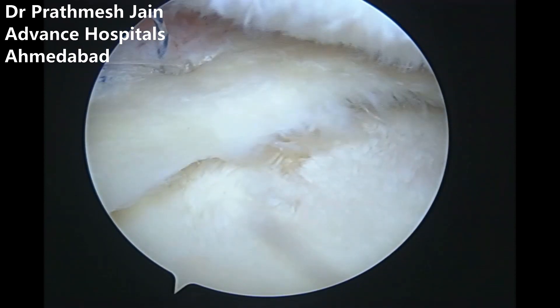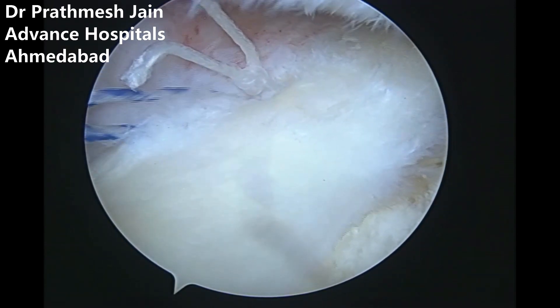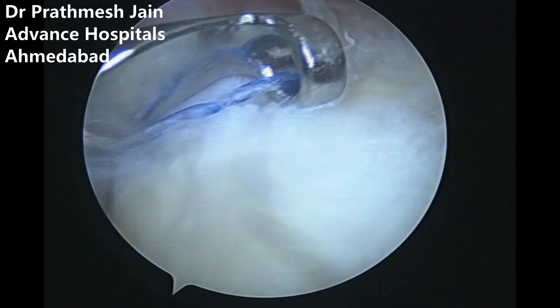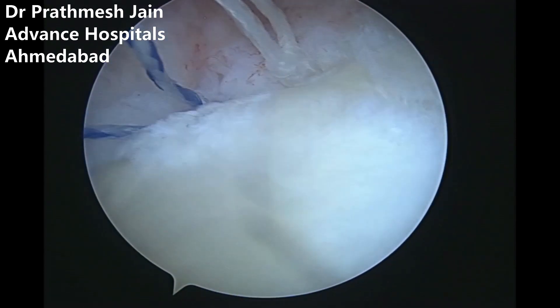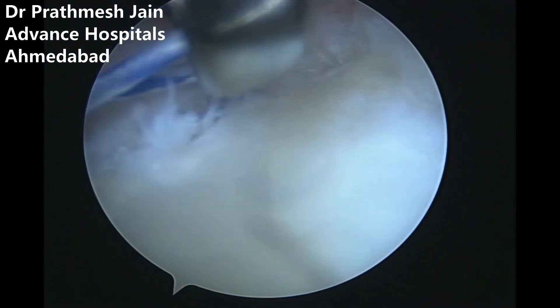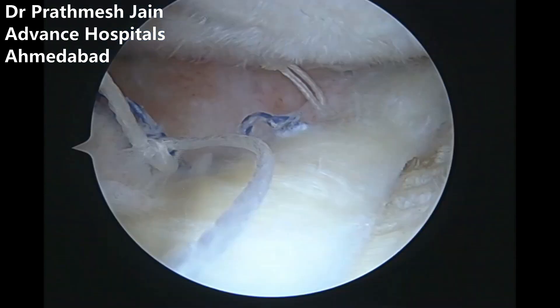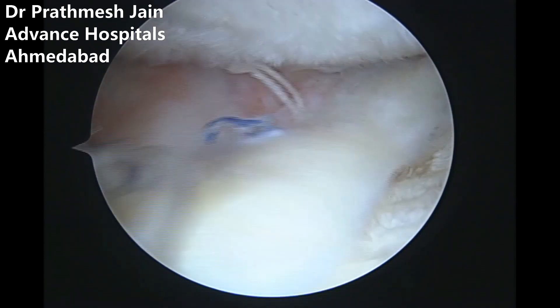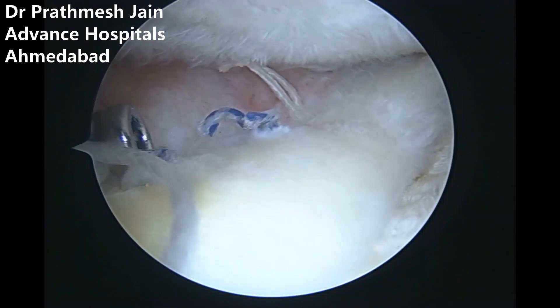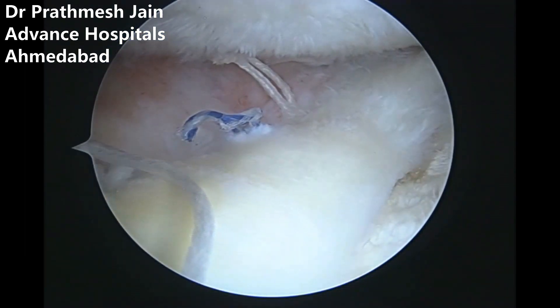The chondral defect on the anteromedial aspect of the tibia will be almost covered once we have repaired the meniscus with the suture anchors — first suture anchor, second suture anchor, repaired sequentially. The anterior part of the meniscus extrusion repair is complete. We use two X-fix anchors for the meniscus extrusion repair.